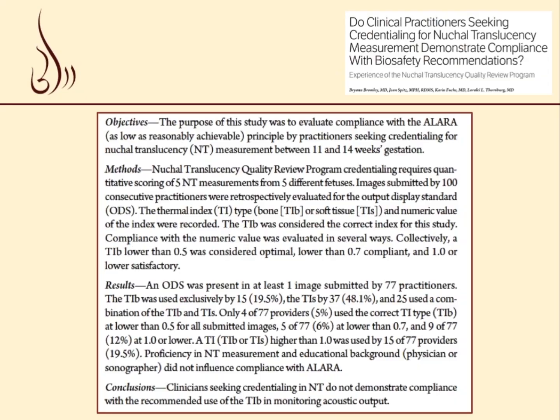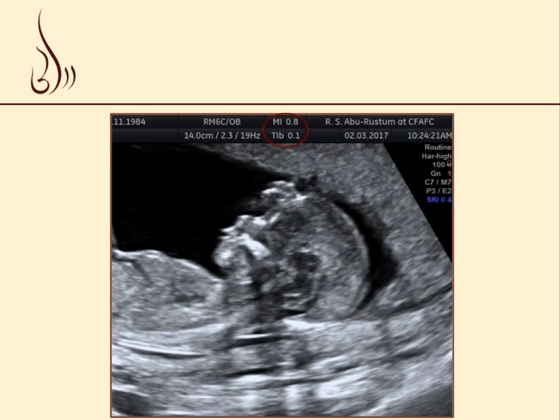Because a recent study from NTQR led by Dr. Bromley showed that clinicians seeking credentialing of NT are not demonstrating compliance with the recommended use of the thermal indices while you monitor the acoustic output on the images. And just as a refresher, we should all be very careful. We should know where the thermal index is designated on our images, and it should be less than 1. And this is critical in the first trimester.